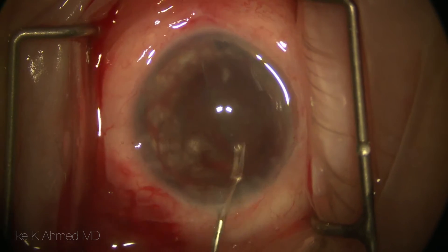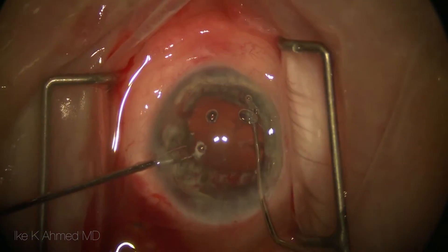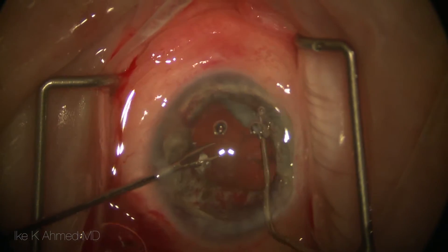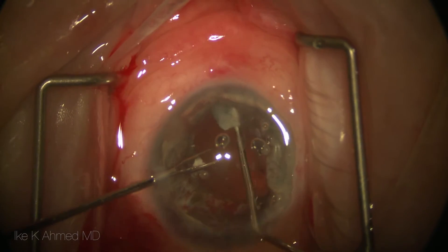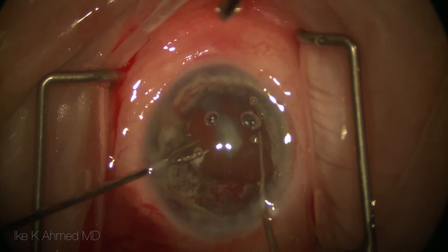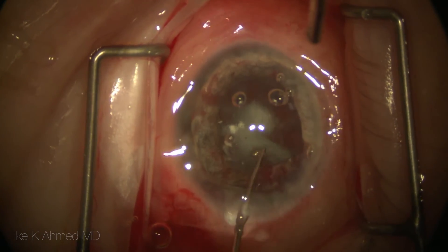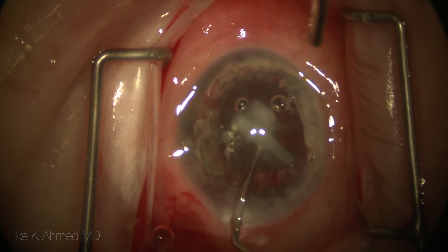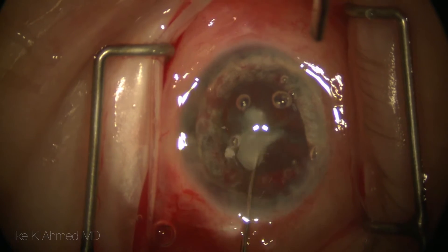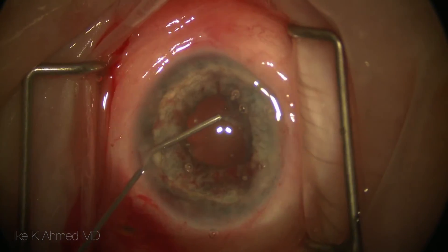It is important to remember that significant viscoelastic has been used to protect the cornea and maintain space in the eye. We can now dissect the capsular bag and visualize the fairly large Soemmering's ring present. This ring tissue is fairly easy to extract from the capsular bag — it is usually not adherent or fibrosed to the capsule — and the Soemmering's ring is then moved into the anterior chamber and extracted out of the eye.